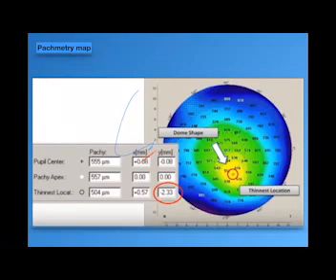But you can accept a deviation of less than or equal to -0.5. If the deviation is -0.5 or less, you can accept, but still suspect. But if more than -0.5 to -1, highly suspect.